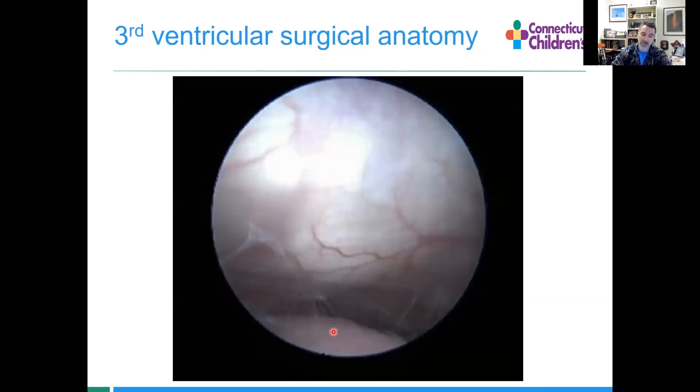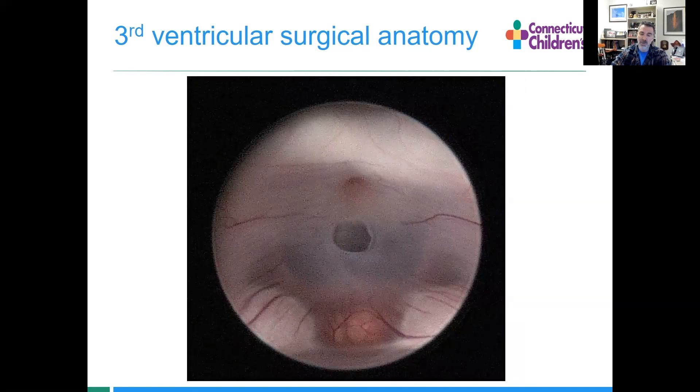What we want to do is poke through. We can see the clivus and the basilar artery. This is what the hole looks like. Let's see what that looks like in real time.